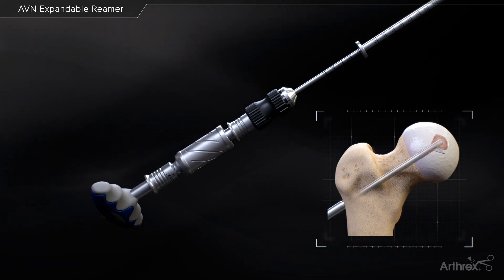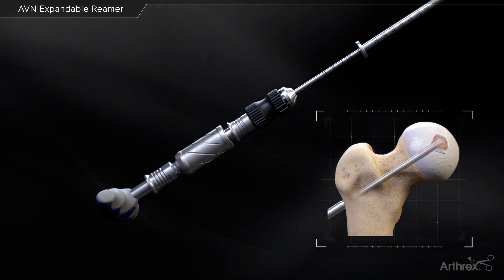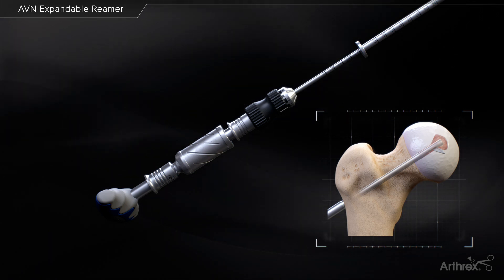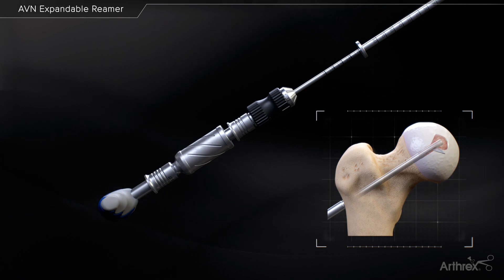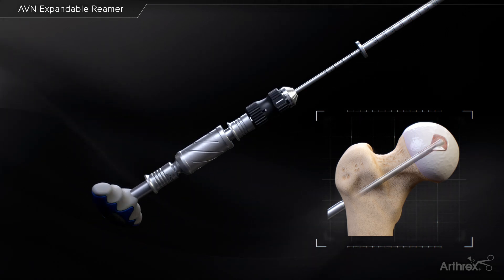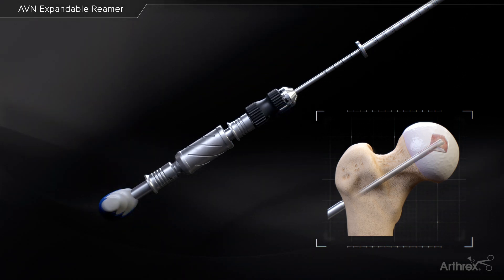If too much torque is encountered in the bone, the torque limiter will engage and not allow the blade to spin inside the socket. If this happens, reduce the diameter of the cutting blade by pushing the knurled knob forward and twist counterclockwise. Once the blade turns easily, expand the blade one or two clicks at a time and resume reaming.